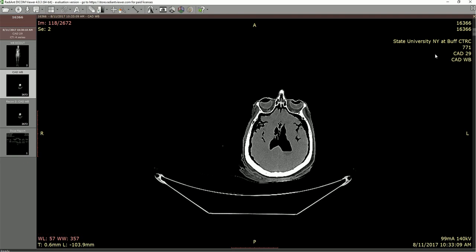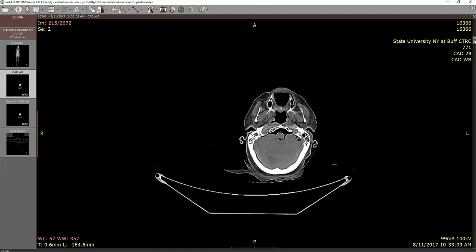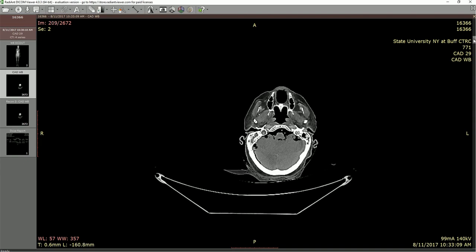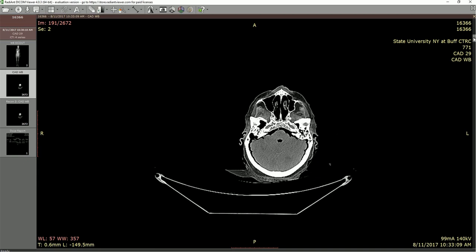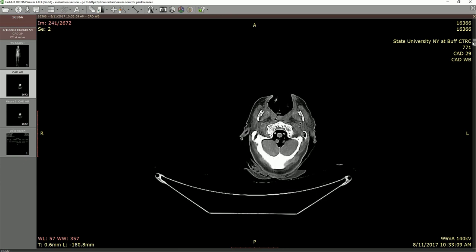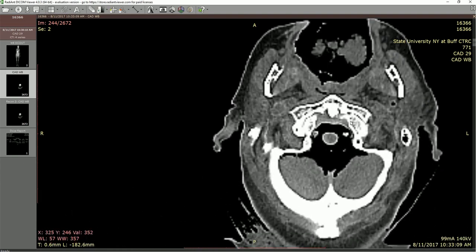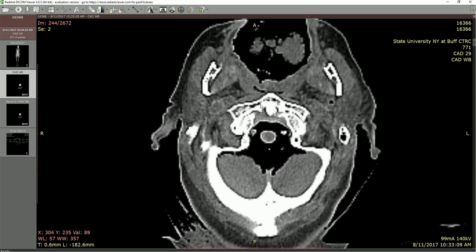You can see the bridge of the nose and the eyes just to give perspective. We go through to the base of the brain. We can't get too many of the foramina of the skull — not enough definition. At the bottom, basically at the level of the foramen magnum, I'm going to zoom in and move to the center. What we're actually looking at here is the anterior arch of C1, and right in the middle we can see the dens. And this would be the transverse span of the cruciform ligament that holds things in place.